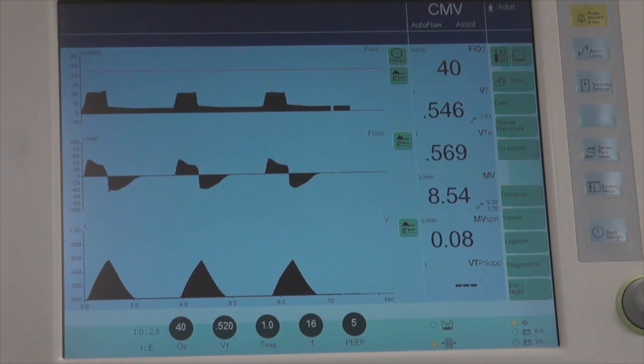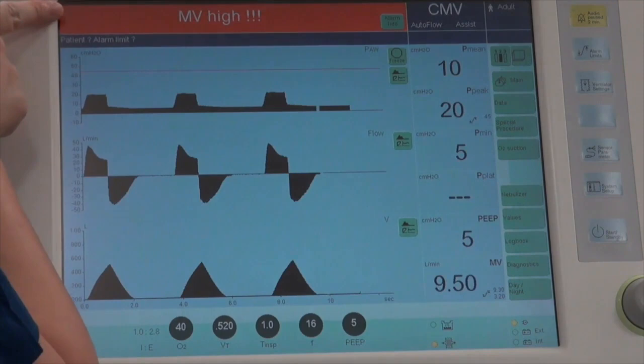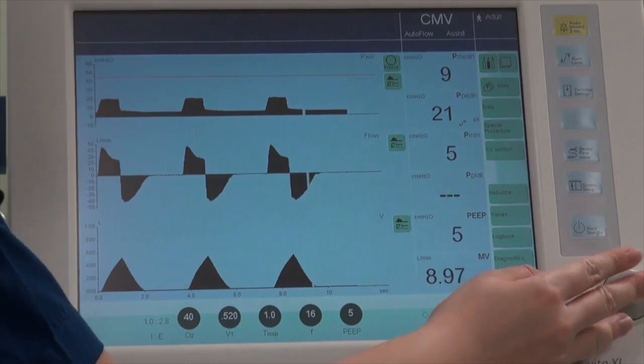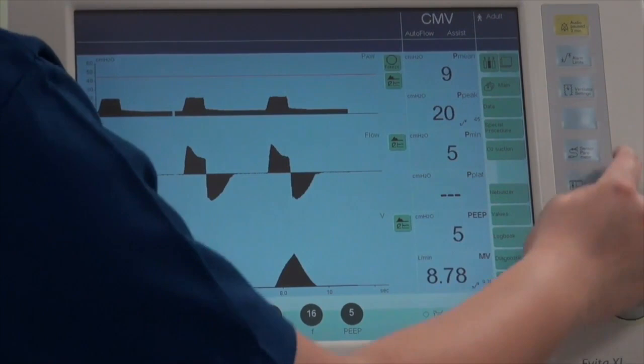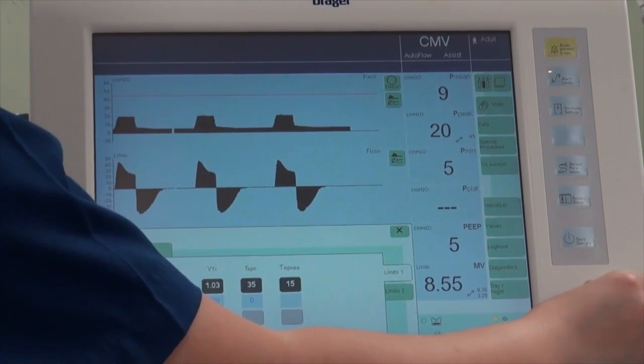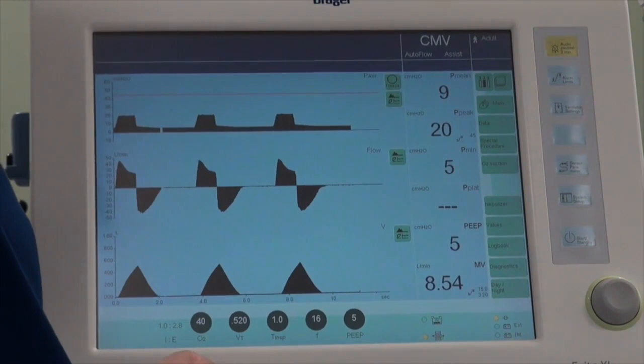In volume control mode, you may want to perform a respiratory maneuver called a plateau pressure. First, navigate to the second page where plateau pressure is shown. Note that when alarms come up, there is both an audio and a color indicator. You can reset the alarm by clicking on it and confirming the reset, but you should also check alarm settings by going to Alarm Limits and adjusting them if not set appropriately, then confirm with the rotary knob and close the window.